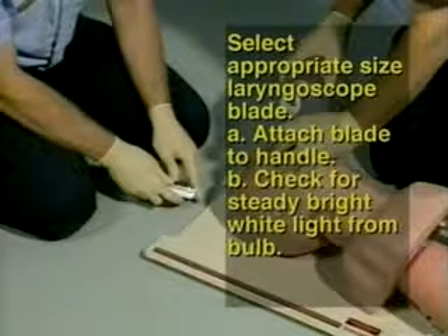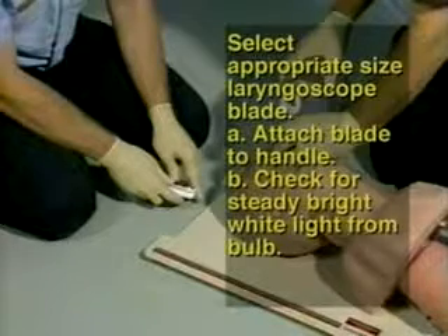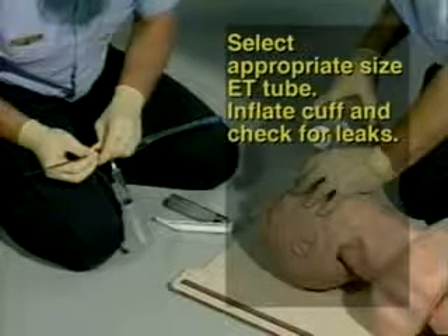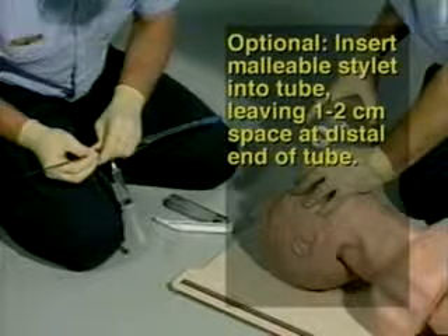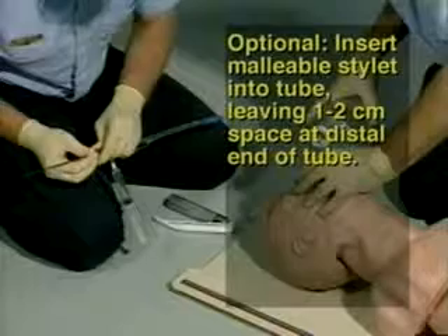Step 3: Select the appropriate size laryngoscope blade. Attach the blade to the handle and check for a steady bright white light from the bulb when the blade is locked in position. Step 4: Select a proper size ET tube. Step 5: Inflate the cuff and check for leaks. Step 6: Optionally, insert a malleable stylet into the tube, leaving 1 to 2 centimeters of space at the distal end of the tube.